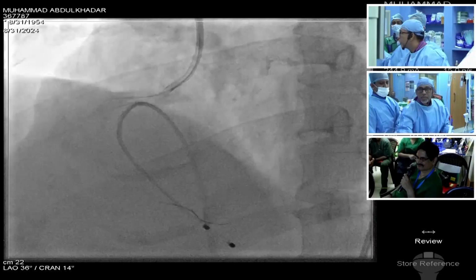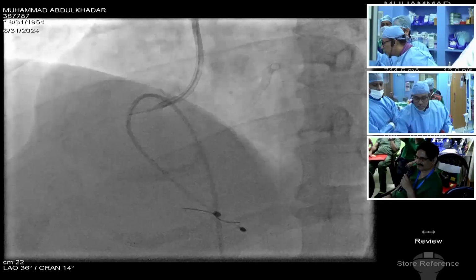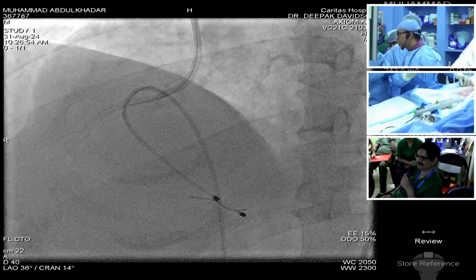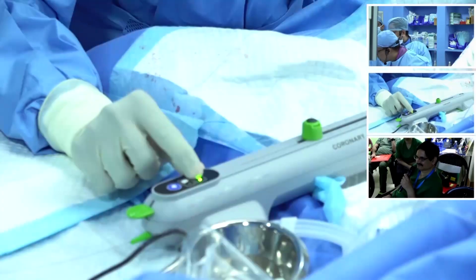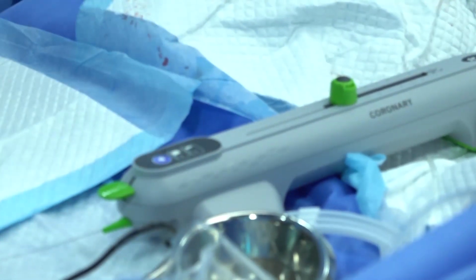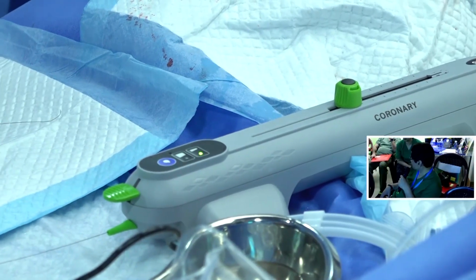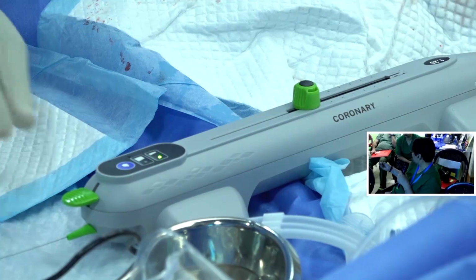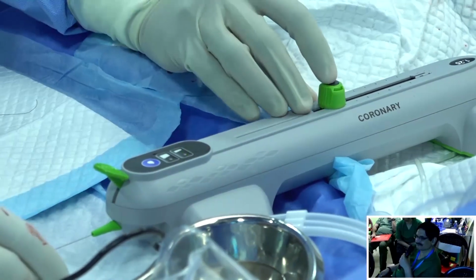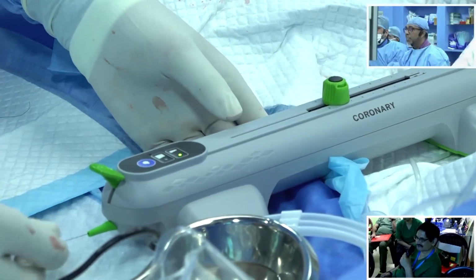Now what we could do is, can you focus over here? We can move on to a mode known as the glide assist mode. While getting the burr inside as well as taking the burr outside, you can hold on to the button. That is the same as the dynaglide mode in Rota. This is low RPM, 30,000 or 40,000 RPM. Release the brake and then again switch it on. Keep pushing the wire inside and take the burr outside. It will come out.